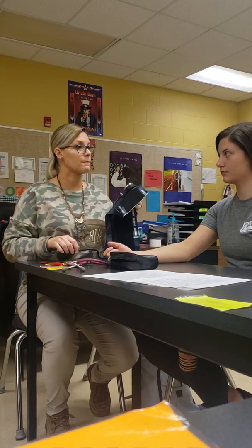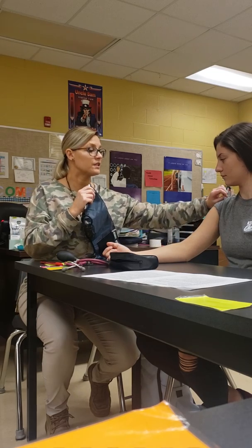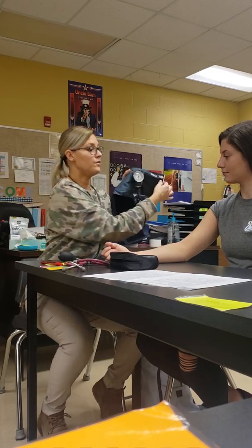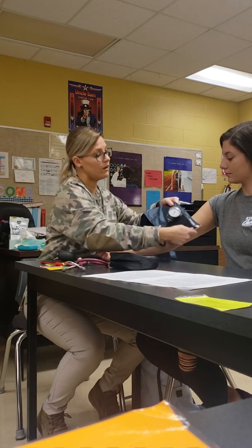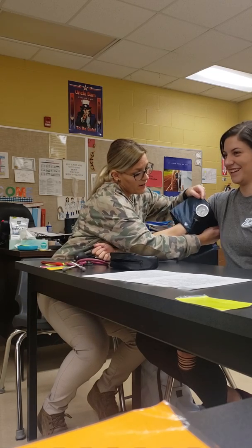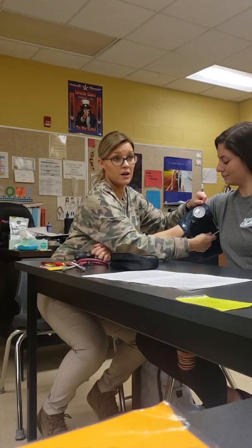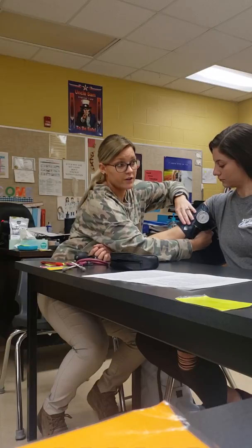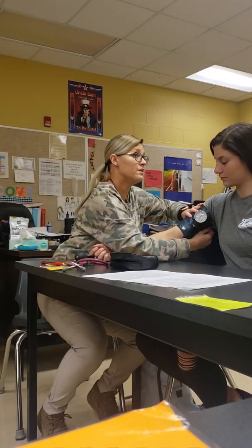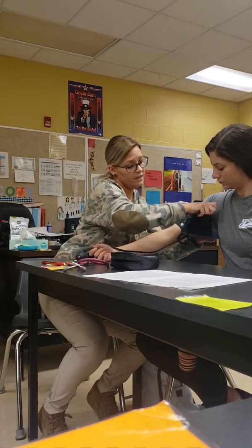So then you're gonna wrap the cuff snugly around the upper arm, at least 1 inch above the elbow. All right. So I'm going to go ahead and pull her sleeve up a little. I'm going to hold the cuff like this, and I'm going to have her hold her arm out just a little because I'm going to get all the way up in her armpit. When I start in her armpit, it lets me know that I'm at least going to be 1 inch above the bend of her arm. So I'm going to make sure that the artery lines up with the brachial artery, which is just to the pinky side of the center of the bend of the arm. I'm going to pull this around tightly, secure it.